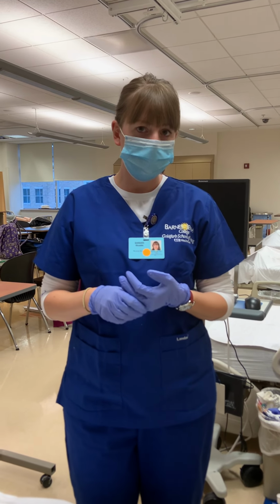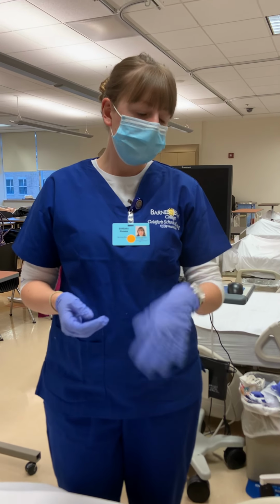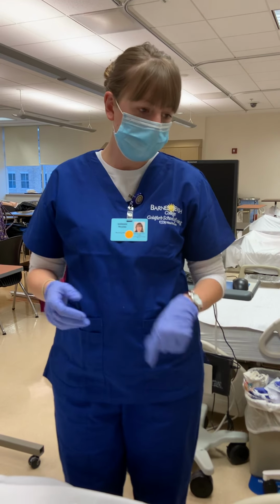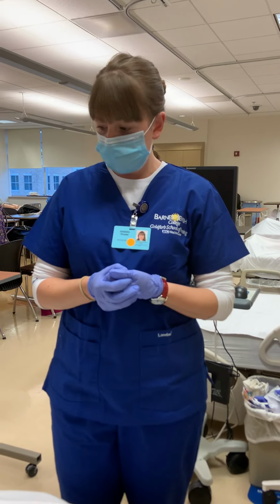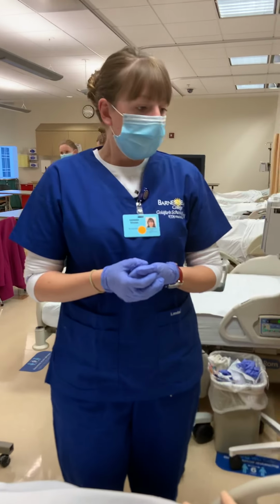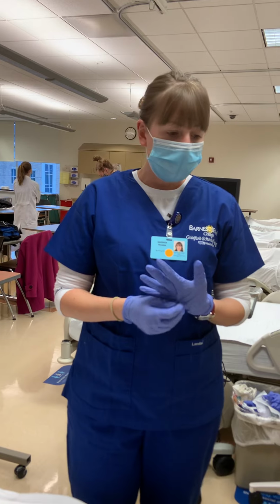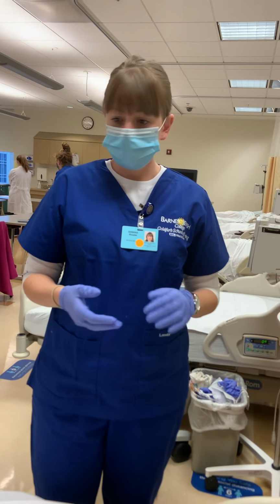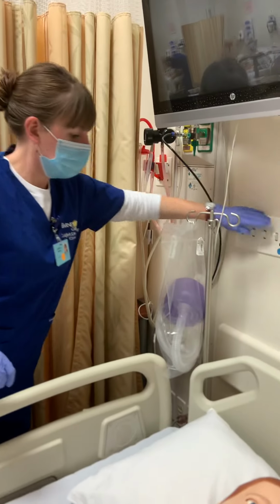I think so. Okay, so basically I'm going to be inserting the catheter to help drain your urine, and we will have a urine bag attached, and I'll just be monitoring your urine output. So right now I'm just going to get things set up, but please feel free to ask me any questions if you have any throughout this procedure, okay? Okay. All right, I'm going to turn all the lights on.